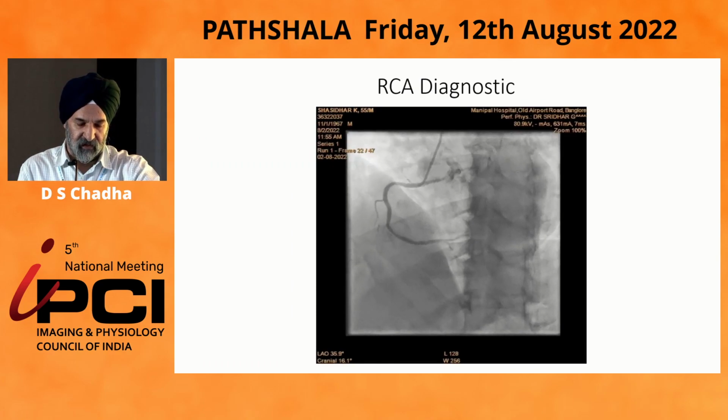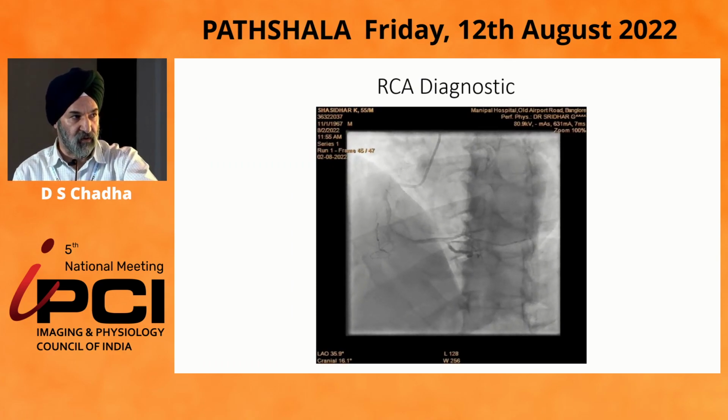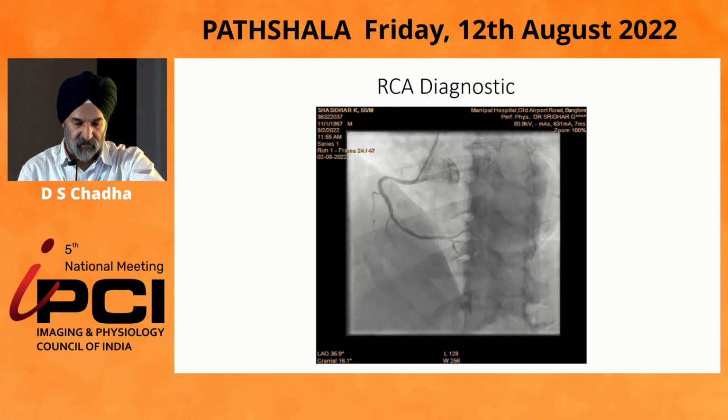But everything was fine. The RCA was fine. We were a little concerned about the RPDA, but the RPDA continued to flow. The plaque had not shown any progression over a period of time.